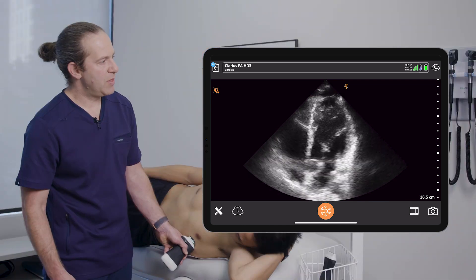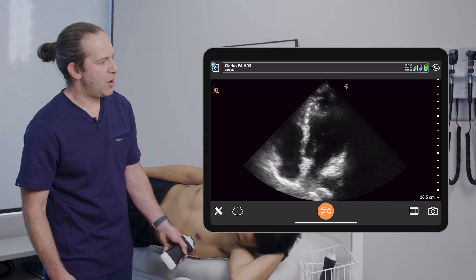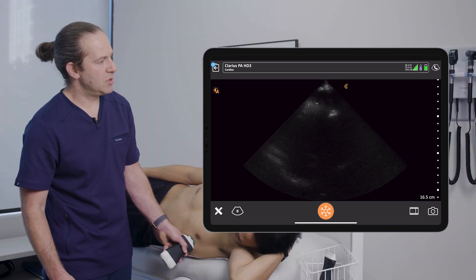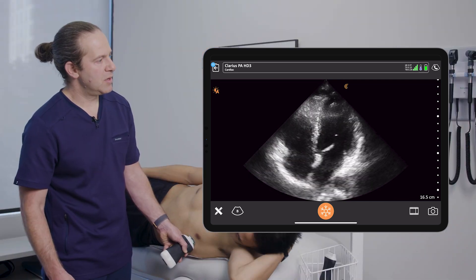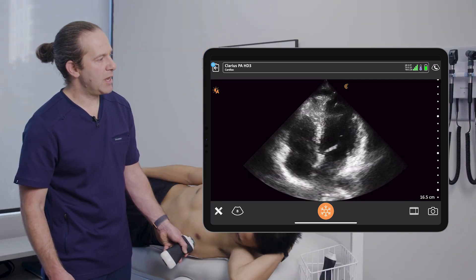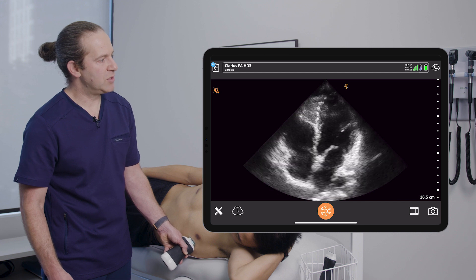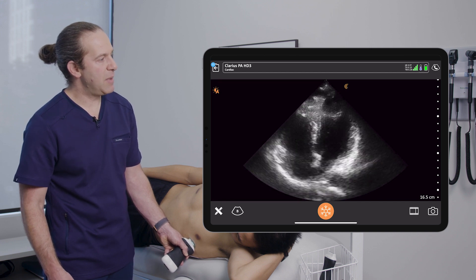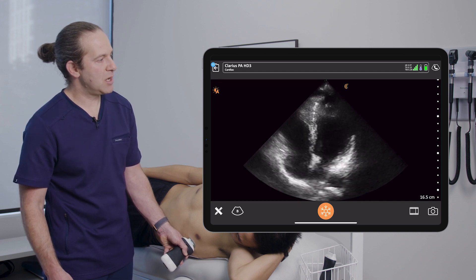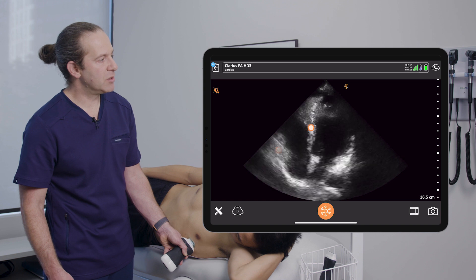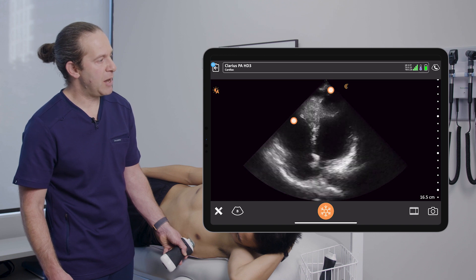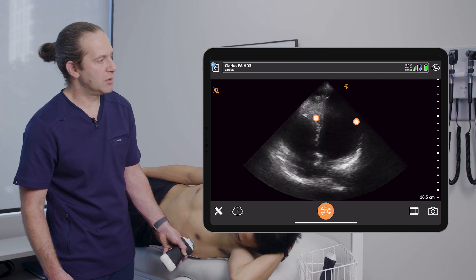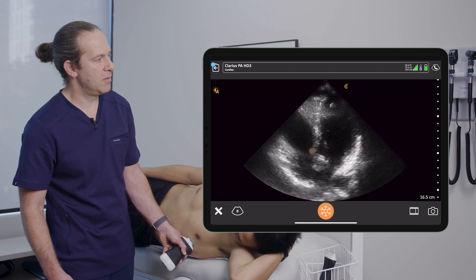Once I'm happy with that and I've got all four chambers in view, this is where I can do pulse wave Doppler and color assessments of the valves and make estimations of the left ventricular function and compare it to the right ventricular function as well.